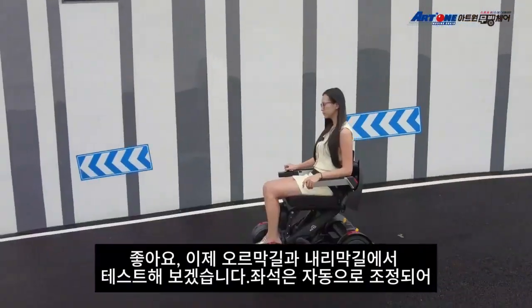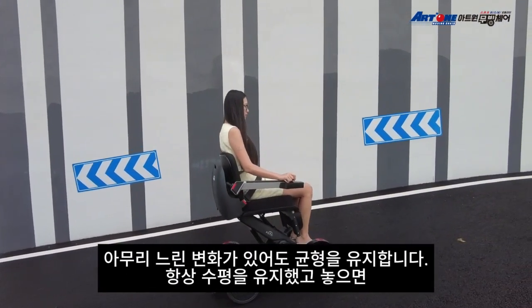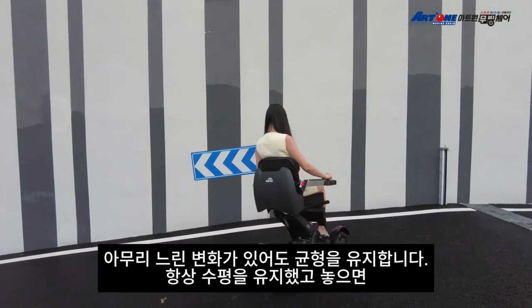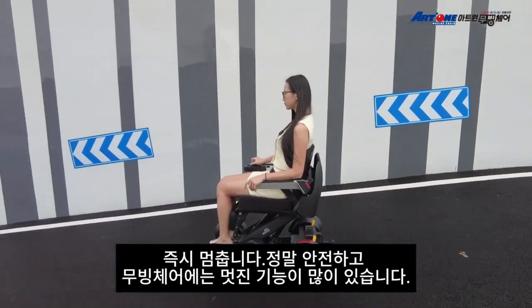Now I'm going to test it going uphill and downhill. The seat adjusts automatically to keep me balanced, no matter how the slope changes. I always stay level, and if I let go, it stops instantly. It's really safe.